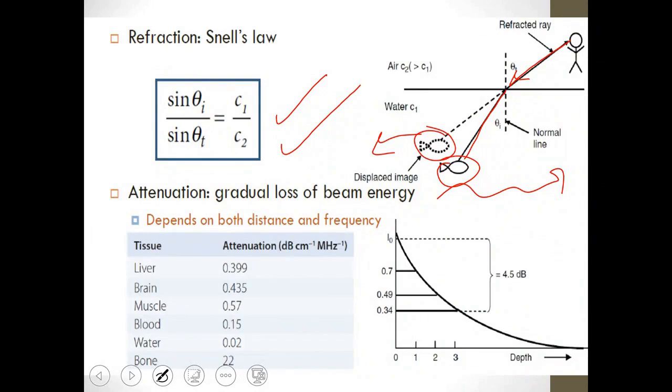It is preferable, for instance, during the imaging process, that the angle of the transducer with the patient's body remains normal. In such cases, you might take images from different angles or different views. Make sure of the location of the lesion or object in this position, or whether it has changed. Different angles or views help you avoid the artifacts that may appear due to the mispositioning of the object.